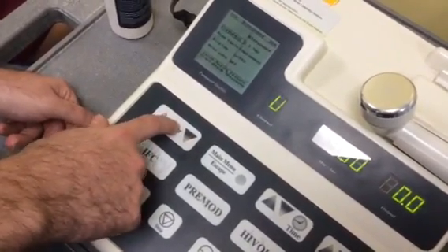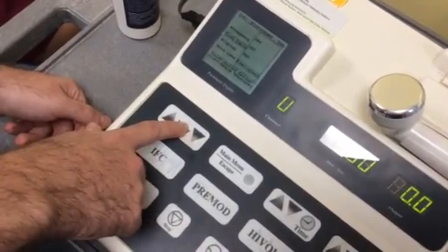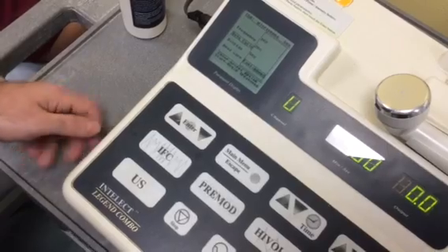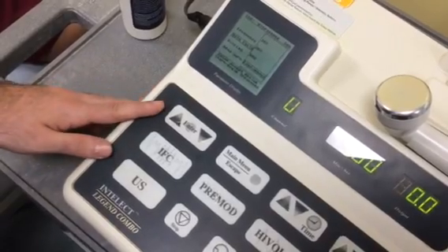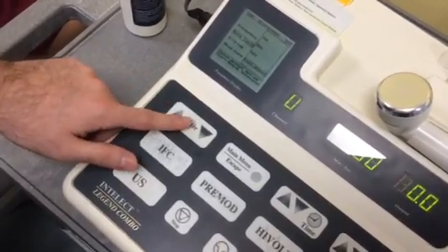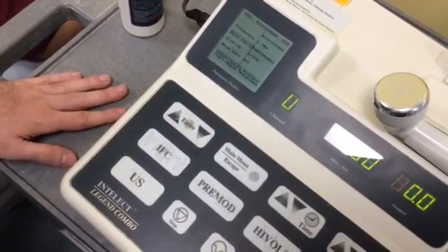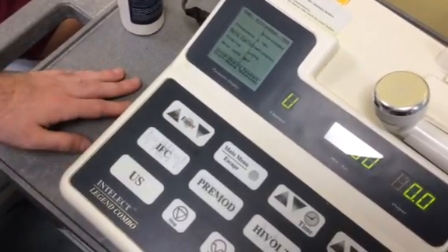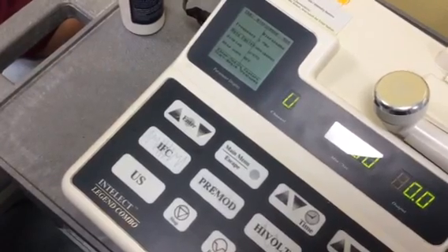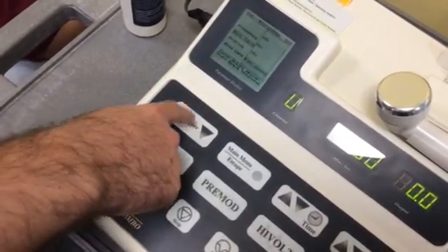In this video we're going to show a continuous ultrasound, so we're going to keep it at 1 MHz. For the duty cycle, as you see in the menu, it could be either pulse or continuous. Pulse is anything that's not continuous — 10%, 20%, 50%, whatever it is. In this video we're going to show continuous ultrasound, so we press continuous, which means it's 100%.